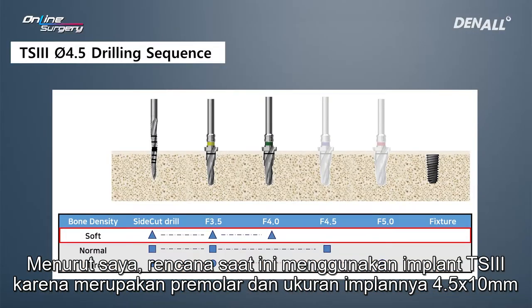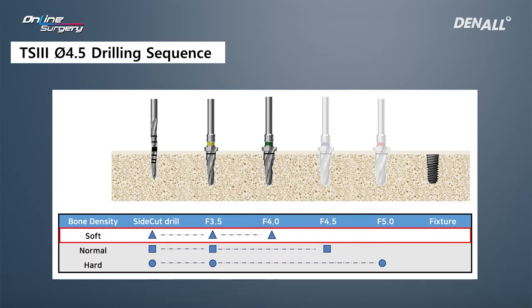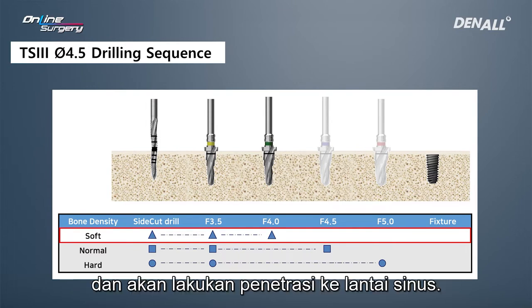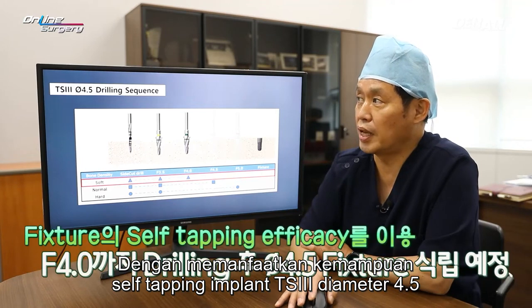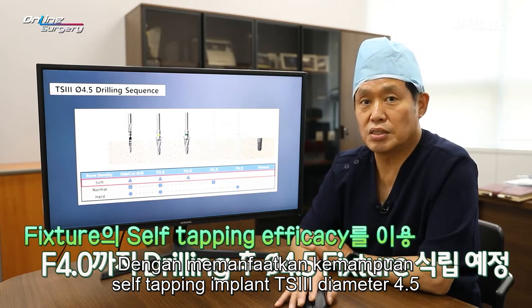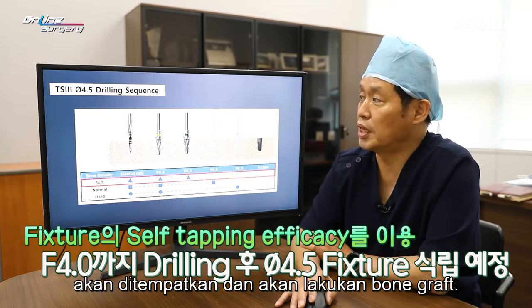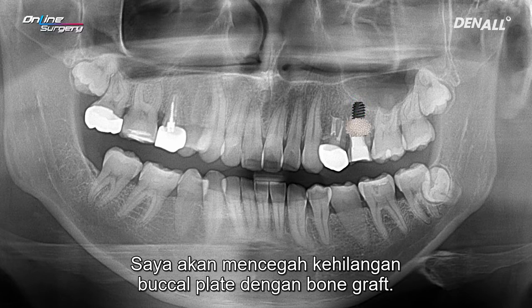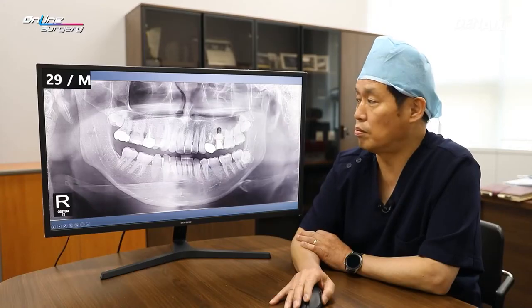In my opinion, the current plan is to use TS3 because it's a premolar and it's a 4.5 by 10 millimeter implant. I'm going to drill up to 4.0, and the sinus floor is going to be penetrated using the good self-tapping ability of TS3 implant. Diameter 4.5 implant is going to be placed, and bone graft is going to be done. As shown after extracting number 25, I'm going to penetrate sinus floor intentionally to get good primary stability from the apex. I'm going to try to prevent buccal plate loss with bone graft.